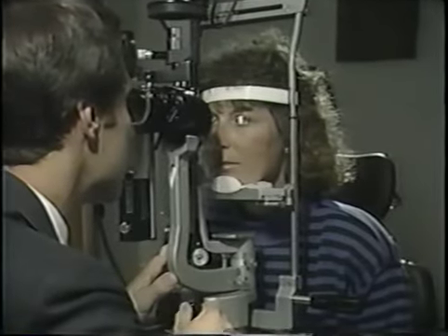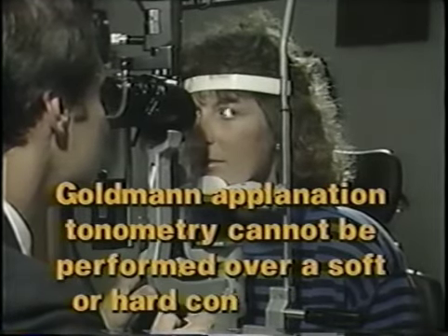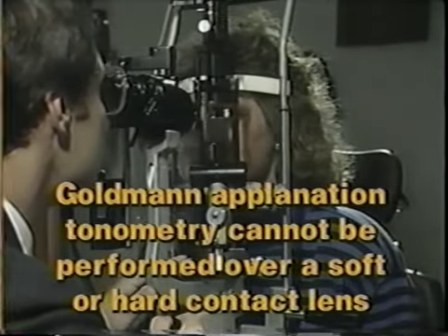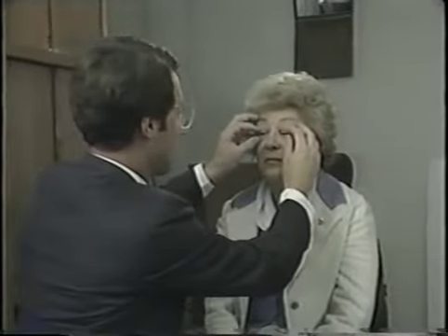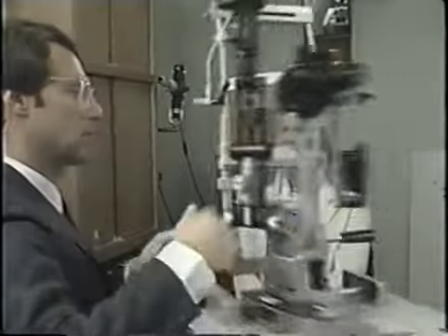Unlike some tonometers, Goldmann applanation tonometry cannot be performed over a soft or hard contact lens. Patients with marked corneal swelling from trauma or surgery may also be difficult to check. There are some ocular conditions where intraocular pressure may need to be checked with the globe rotated out of primary gaze. For example, in patients with thyroid eye disease, intraocular pressure may be higher in upgaze.